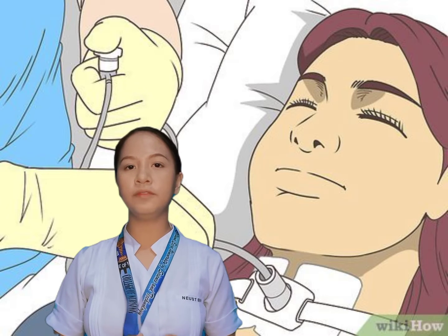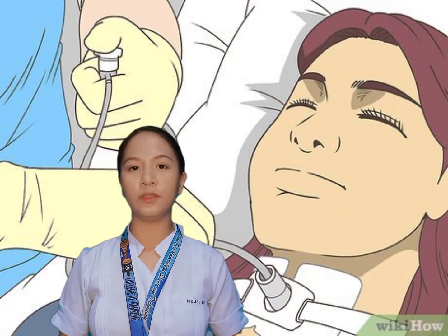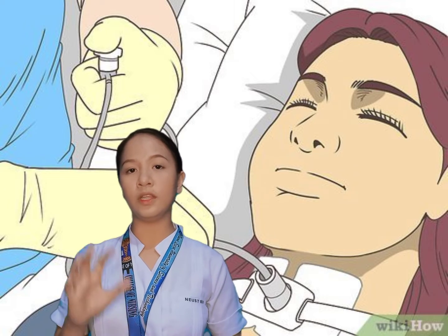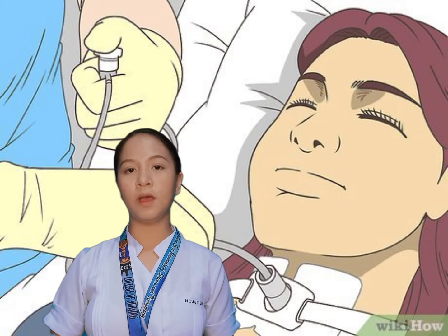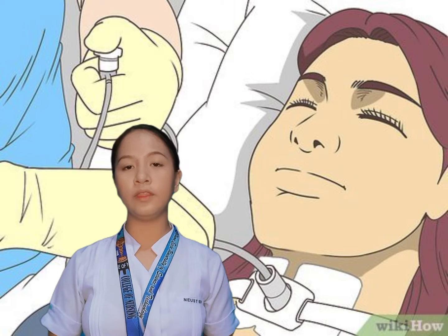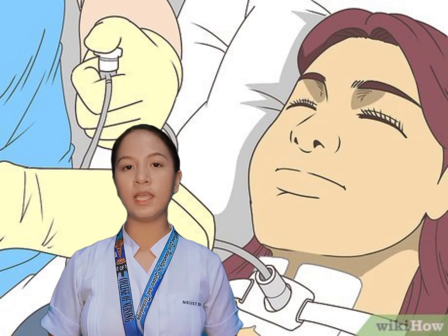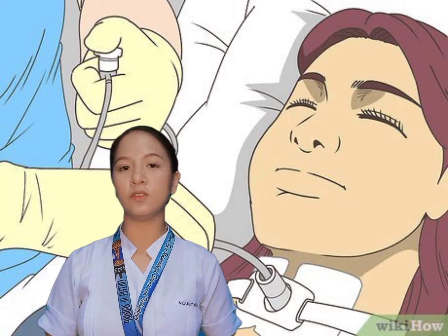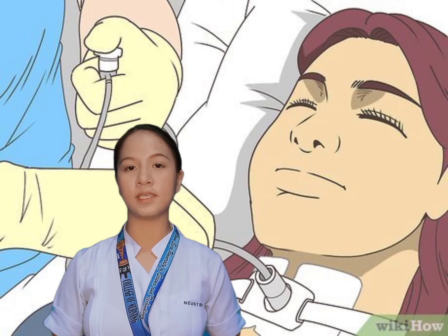Next, remove the oxygen source if one is present. Stabilize the outer cannula and faceplate of the tracheostomy with your non-dominant hand. Then, grasp the locking mechanism of the inner cannula with your dominant hand. Press the tabs and release lock. Gently remove inner cannula and place in first basin with plain NSS plus H2O2. Let it submerge there for a few minutes.